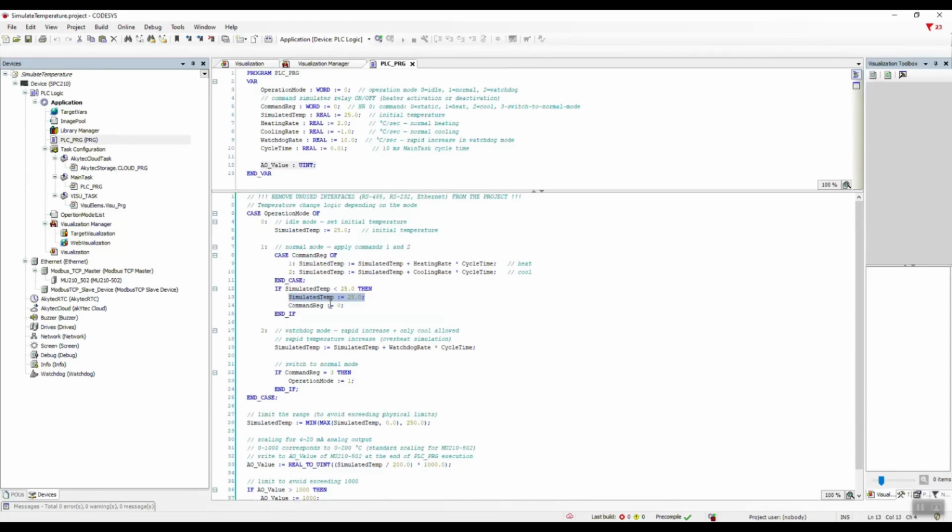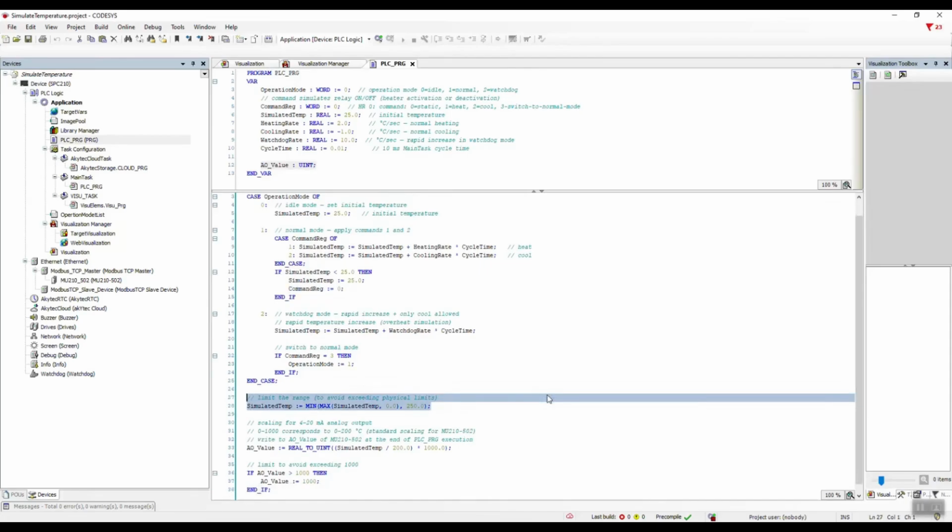We also reset the sterilizer command to 0 in order to stop the process of changing the temperature inside the sterilizer. The next expression limits the simulated temperature output to stay within the allowed range of 0 to 250 degrees Celsius. But we want to simulate a temperature from 0 to 200 degrees Celsius, so let's adjust this expression.